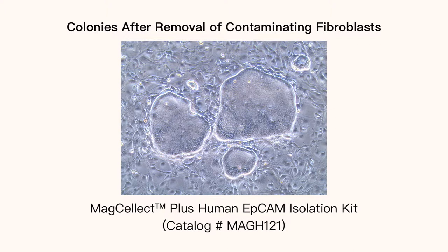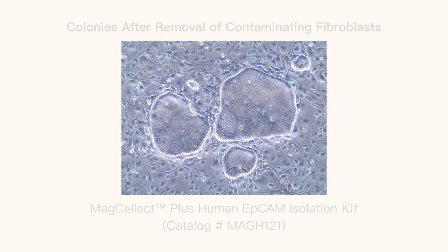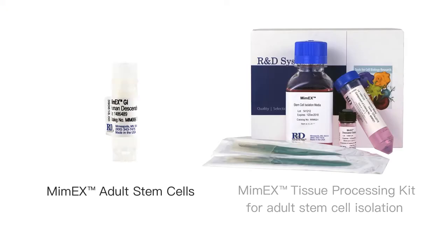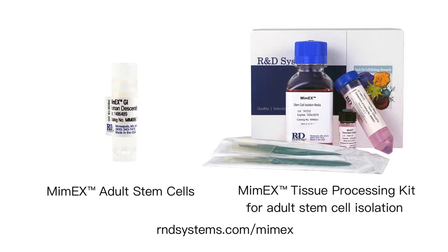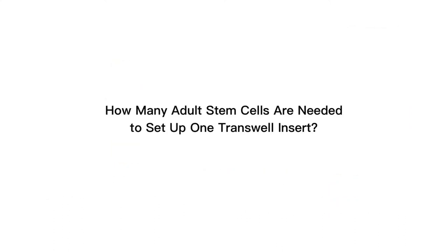Images on the screen show examples of adult stem cell expansion cultures with host tissue fibroblast growth. If fibroblast contamination is detected, the culture can be cleaned up using the MAG Select Plus Human EpCAM isolation kit. R&D Systems also provides Mimics adult stem cell lines, which are cryopreserved as high-density purified populations and are already free of host tissue fibroblast contamination.